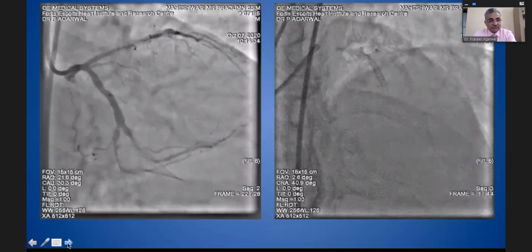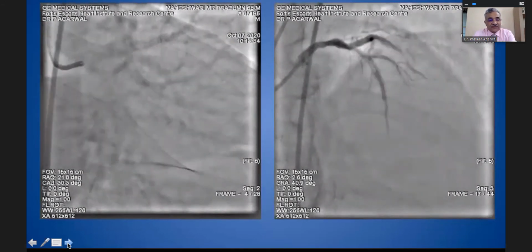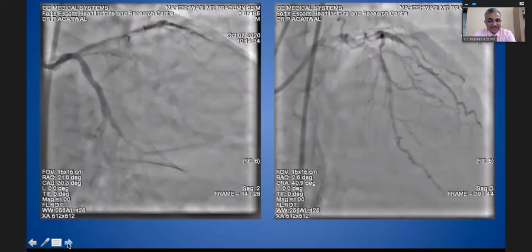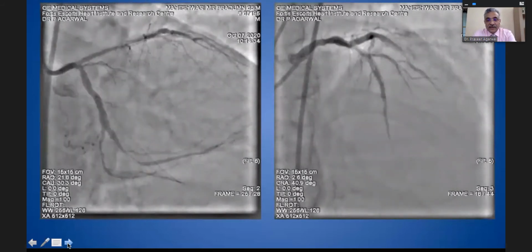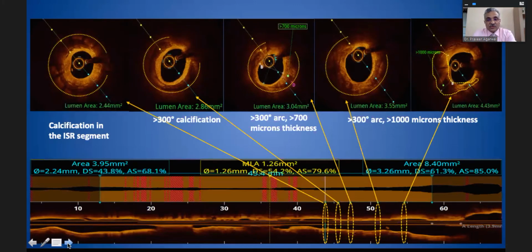Now let us share some examples. This is a 68-year-old gentleman who comes with an in-stent restenosis. The stent was placed about 8 or 10 years back. He comes with angina, and after initial 2 mm balloon dilatation, OCT was taken. Now see this plaque. This plaque is fibrotic and calcific. The arc of calcium is more than 300 degrees, and thickness is about 700 microns. If you don't modify these plaques, stent expansion within a stent becomes really difficult.